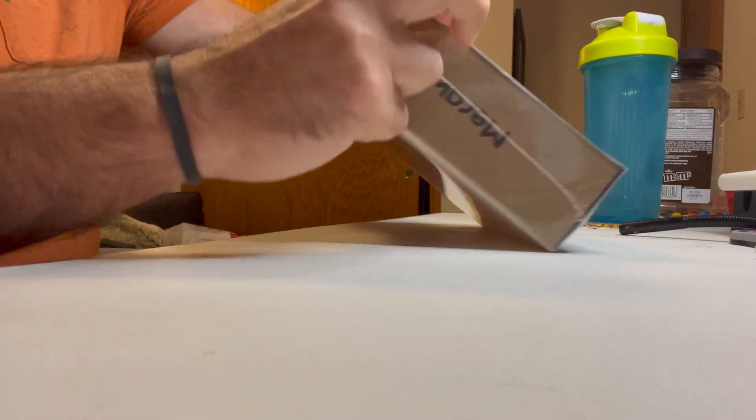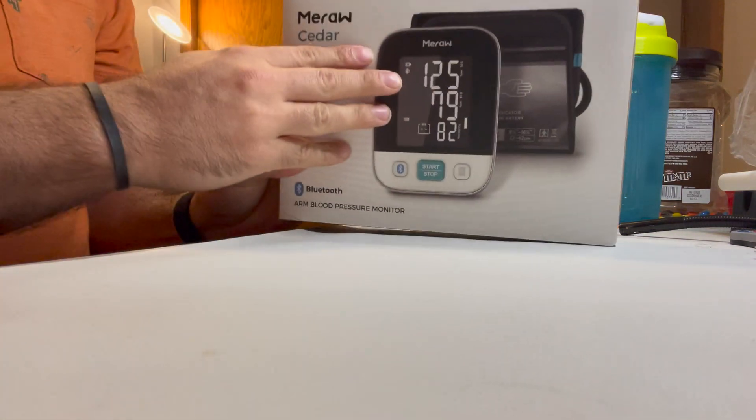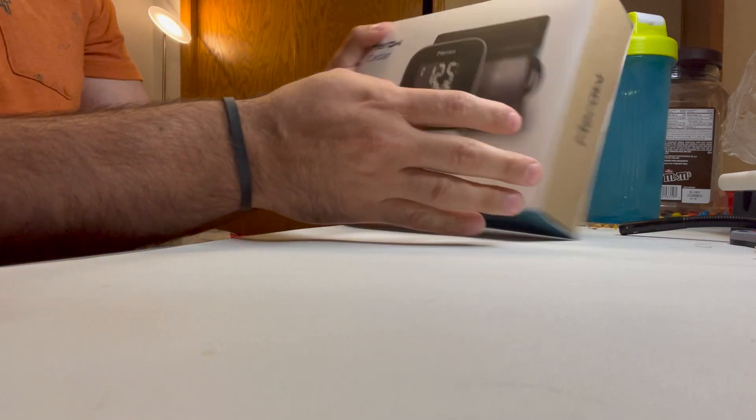And once the plastic is off, we'll go ahead and show the contents of what's inside. So there's the box right here. You can see it says Meraw right there.